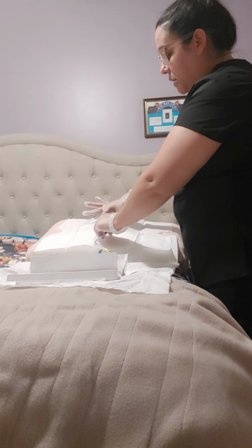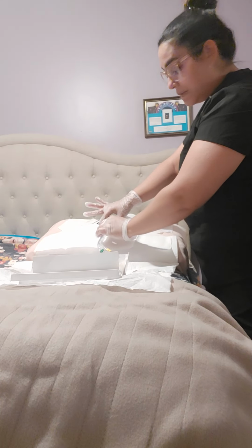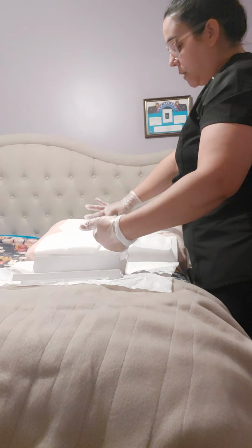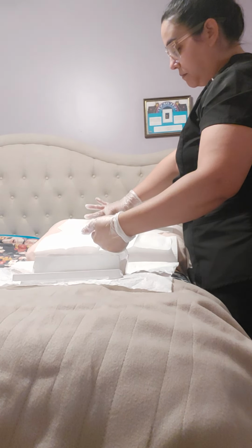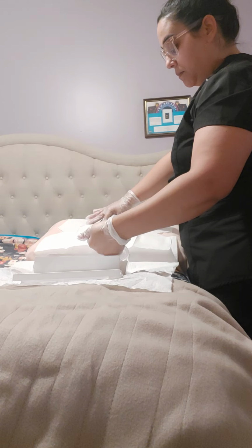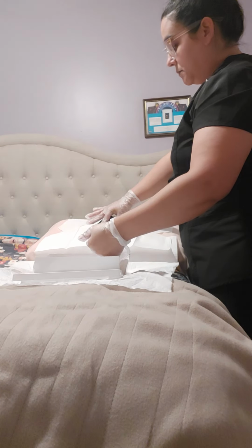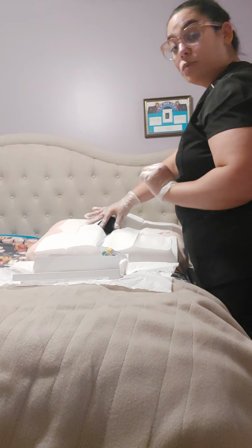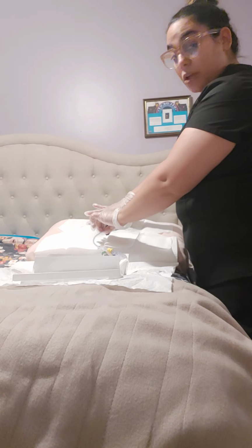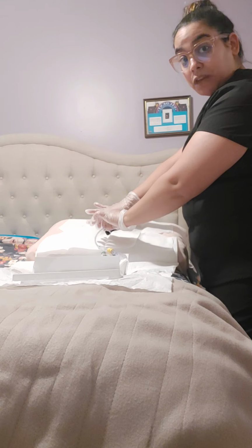Once you have gotten some urine return, you would still put it in about 1 to 2 more inches. Now that it is in, I would fill up my balloon completely. Once your balloon is filled completely, you would tug on the catheter to make sure that it doesn't come out. And the reason why we're doing this is to make sure that we are past the sphincter.